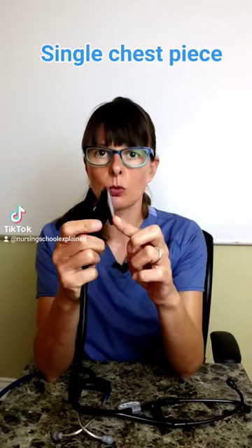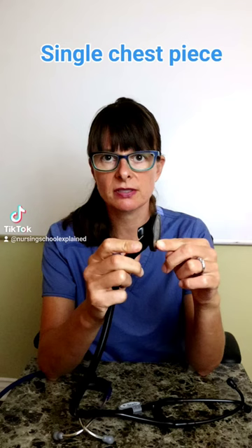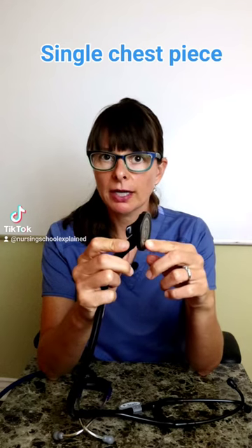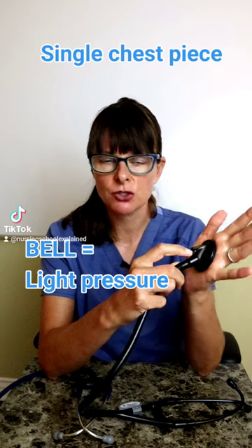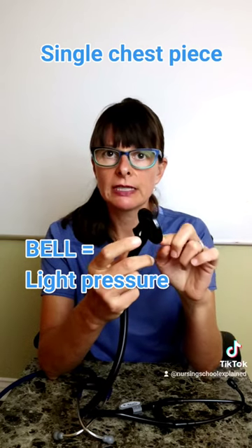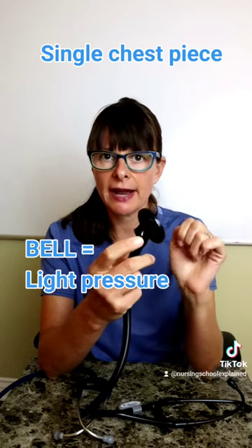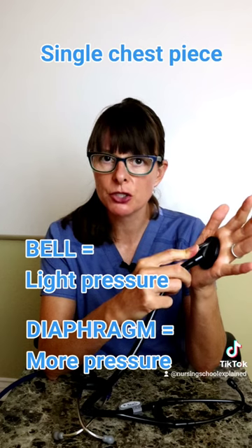In a stethoscope like this that only has one surface that will touch the patient's skin, the bell can be initiated by having just light pressure against the patient's chest, whereas if you need to use the diaphragm, you need to exert a little bit more pressure against the patient's chest to hear the appropriate sounds.